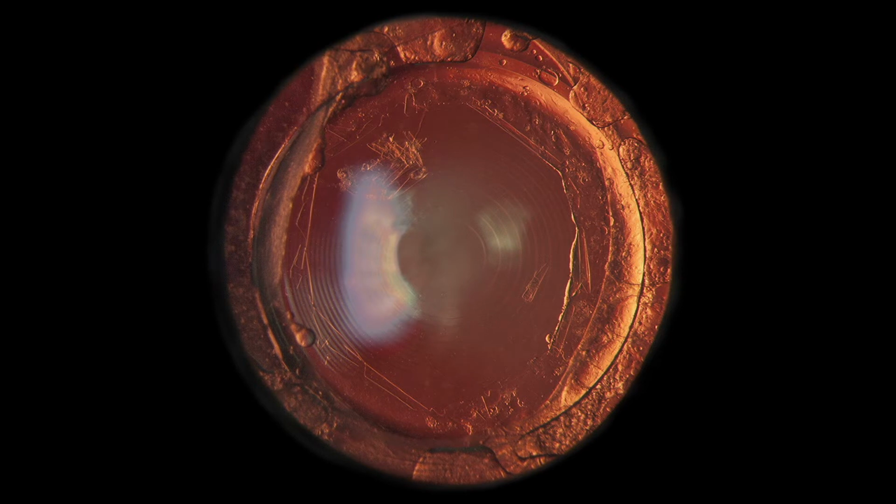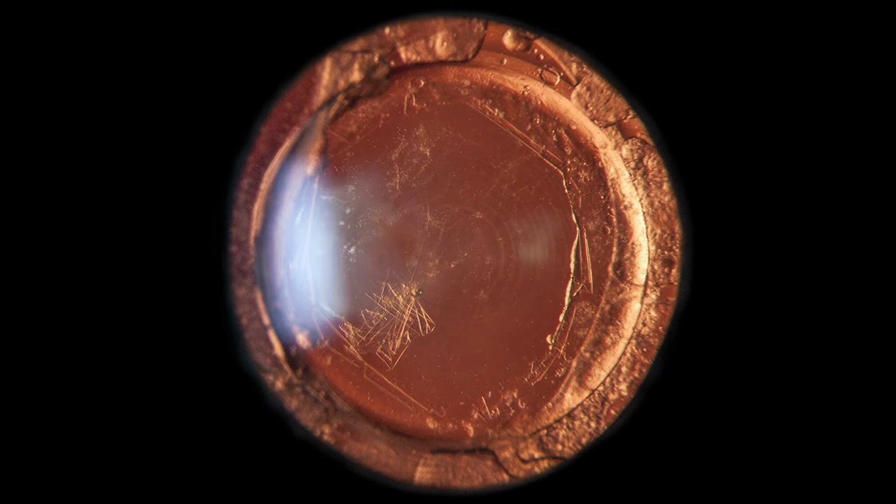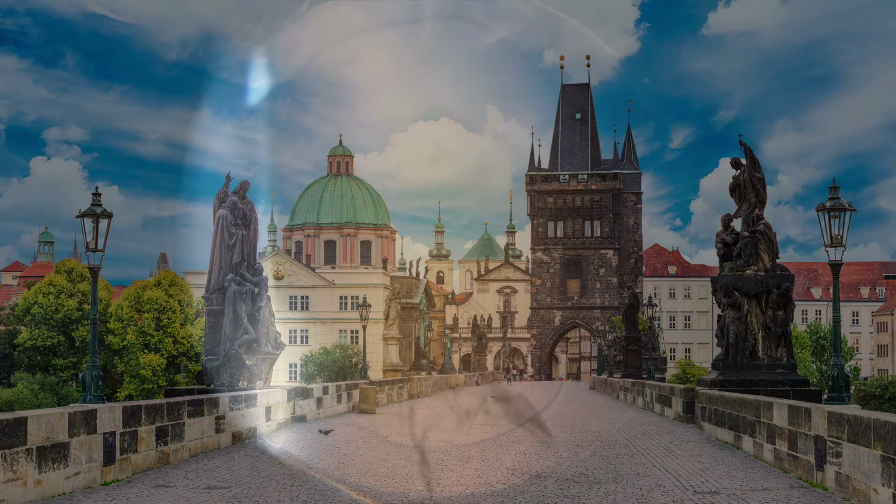It is not uncommon for this to remain in the area of the optical axis, fully oscillating with all eye movements. Fortunately, not all patients will perceive this capsular remnant. However, some will be severely impaired by it, as you can see in the following example.